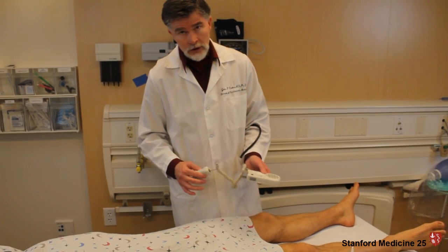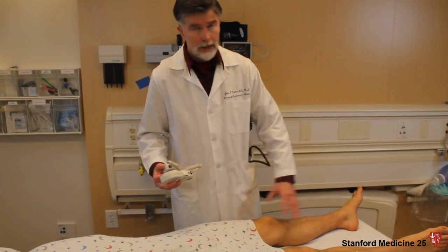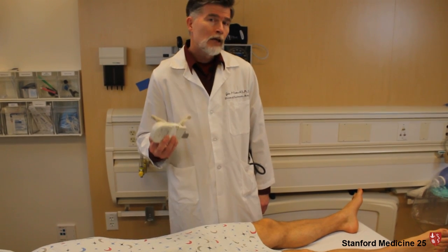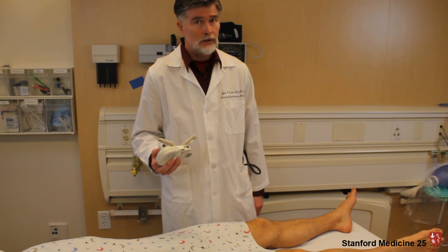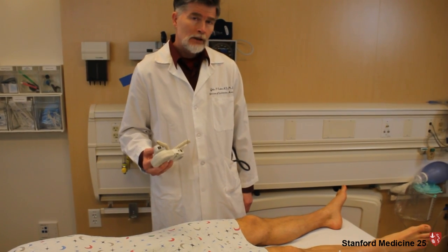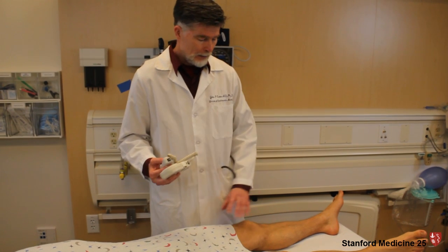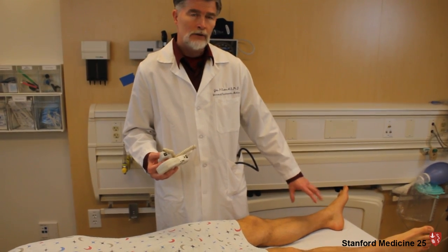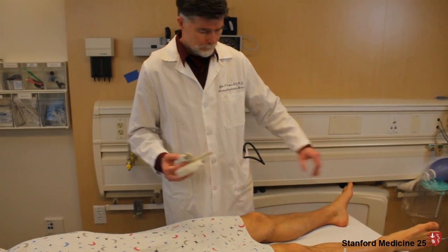That's checking for the patency of the veins in the lower extremity using a handheld Doppler. But you can also check for venous insufficiency as well. In that case, you're doing the compression proximally and looking for venous flow distally.